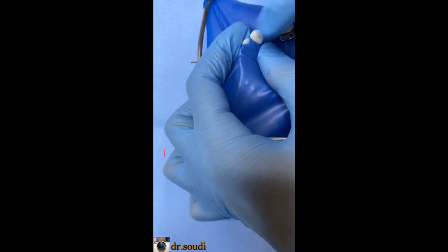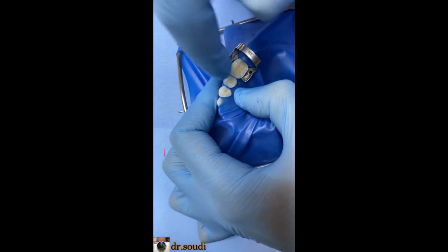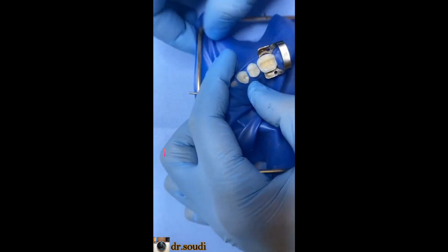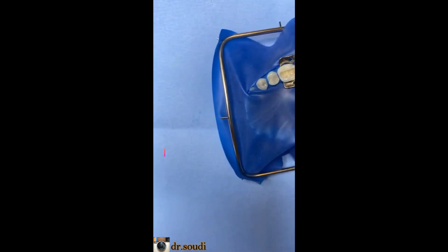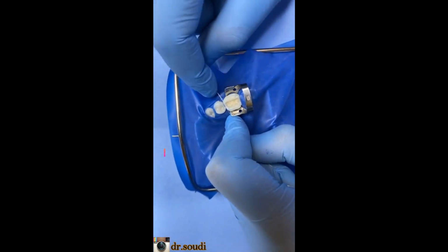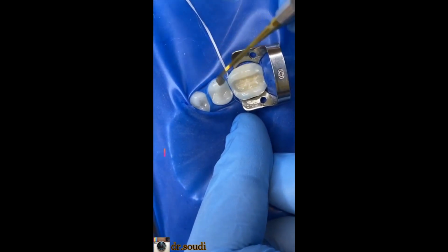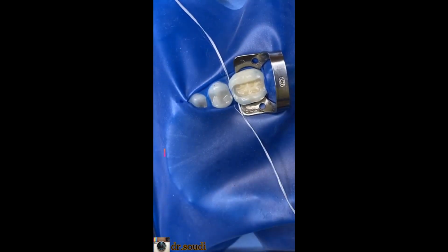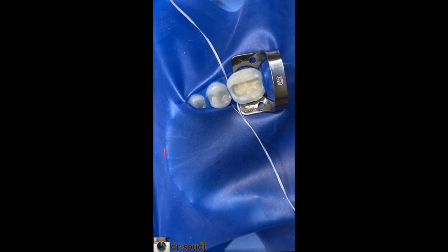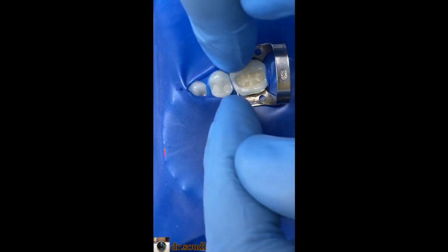If you have a tight contact like this and you cannot pass it, you can ask your assistant to pass a dental floss here, okay? But I don't have an assistant, so like this, floss, and you press like this, press downward. Okay, hopefully this happens. You can see now after I press the floss downward, you now can see a piece of the sheet. If you remove the floss completely, this sheet will tear.